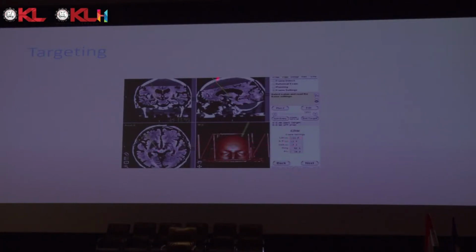Initially we will use MER electrodes. We put them in and record the brain from the striatum, thalamus, across the zona incerta and subthalamic nucleus, even the SNR also. After recording, we will identify the structures. And sometimes we use GPI for some Parkinson cases and dystonia also.